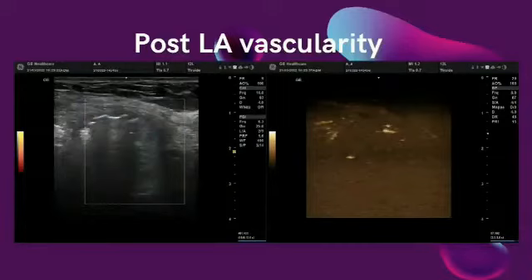At post-treatment vascular control, the lesion appears completely avascular at both PD and B flow. The treatment can be considered concluded when the volume of the hyperechoic area remains stable. The evaluation of the treatment's effectiveness is performed through the Doppler analysis.